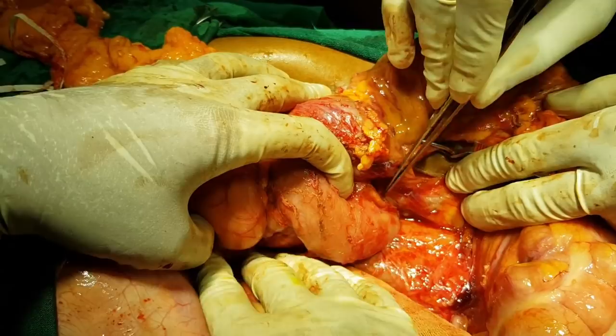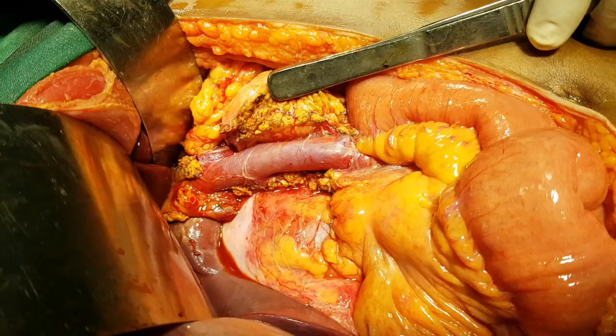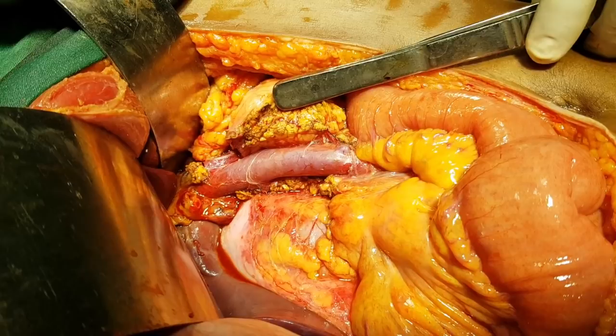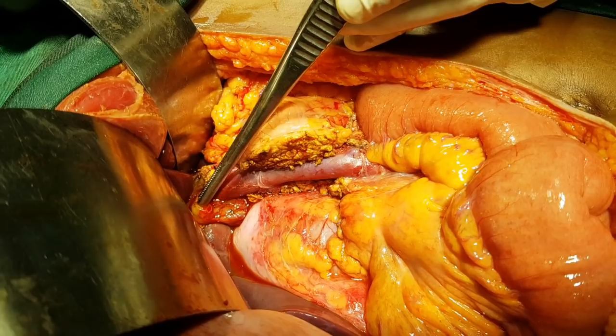You can see such a bulky tumor — this is a case of neuroendocrine tumor, a bulky neuroendocrine tumor. Now we are going to see the bile duct. The distal bile duct is shown there. You can also see the superior mesenteric vein going up, joining with the splenic vein and forming the portal vein.